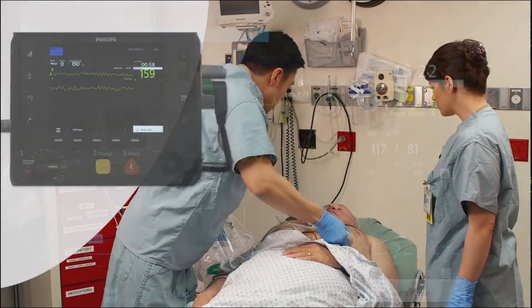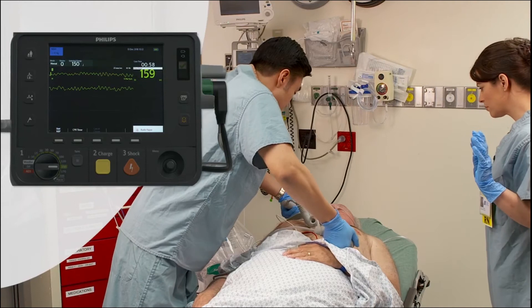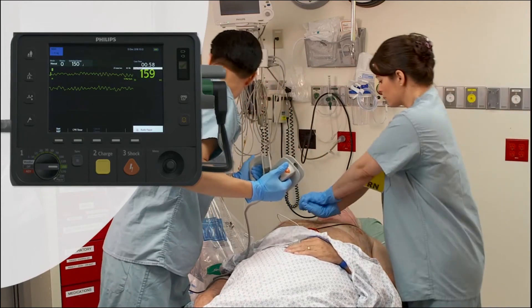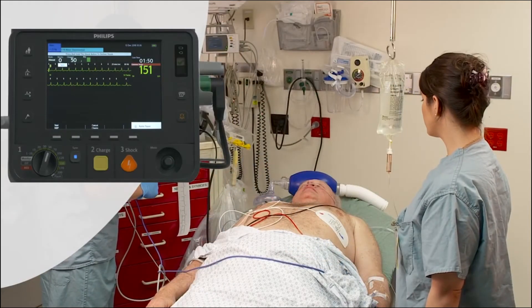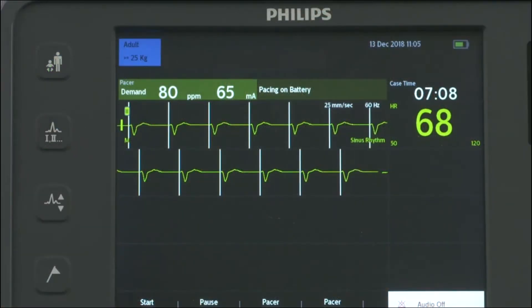Manual Defib Mode offers easy 1-2-3 defibrillation using multifunction electrode pads or external or internal paddles. Manual Mode also allows you to perform synchronized cardioversion. The optional pacing mode offers non-invasive transcutaneous pacing therapy.